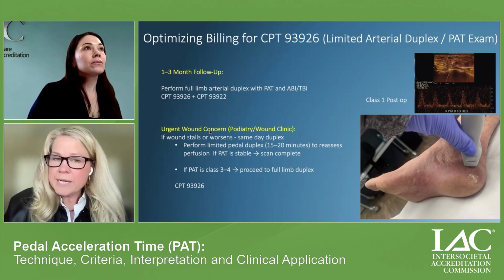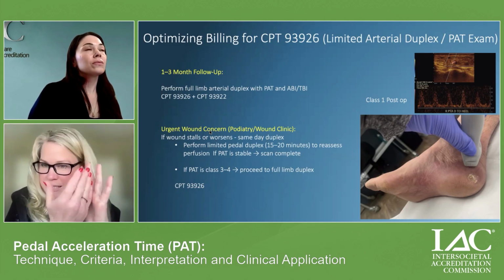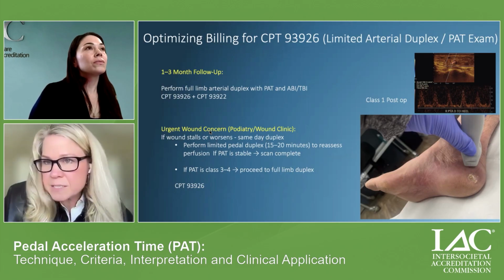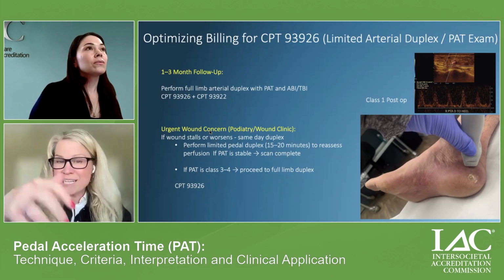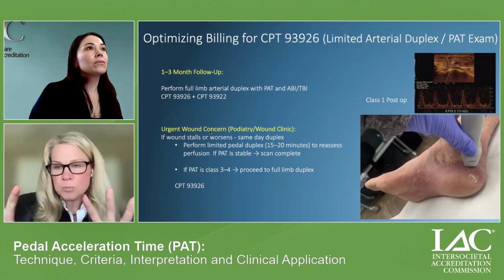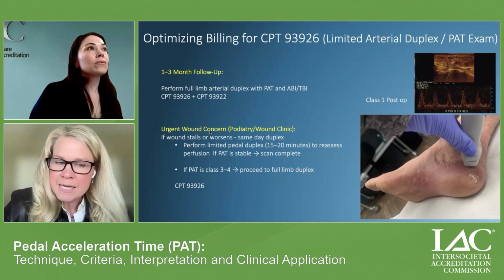But remember, just like the palmar arch, we can have a complete palmar arch, or we can have an incomplete pedal arch. And sometimes we don't see retrograde or antegrade flow because the pedal arch is not intact. So retrograde flow is not a bad thing. It just means our body is collateralizing, just like it would around the circle of Willis. But normal flow is towards the toes on the top and the bottom of the foot.